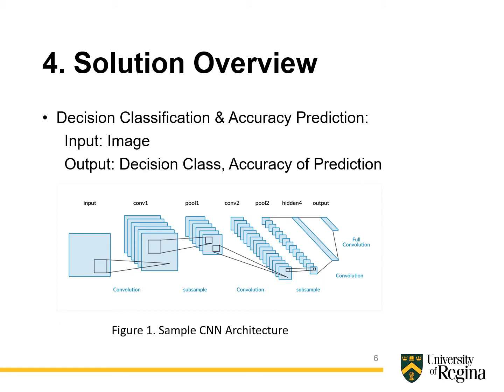Recognizing the decision class, that is COVID-19 positive or COVID-19 negative, is considered as an object detection task. This is achieved by taking the dataset and imposing the convolutional neural network architecture over the dataset and training the model, as shown in the figure.